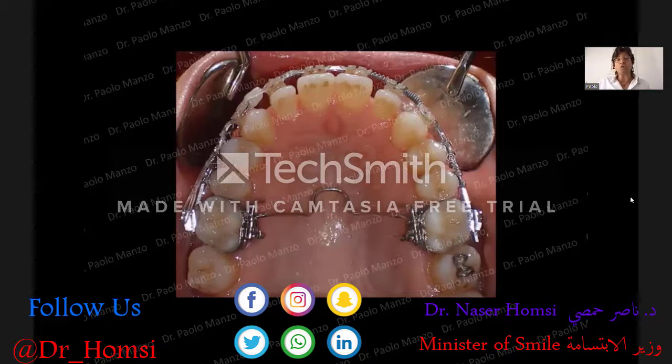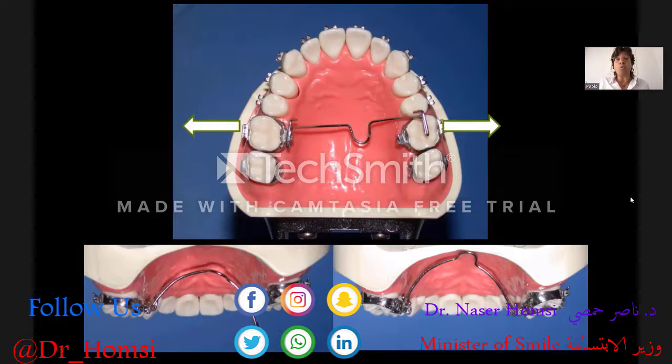And with transpalatal arch, we can expand only one side, like the right side. How to expand only one side with a transpalatal arch? The transpalatal arch is one single device. So if we expand like this, we expand at left side and also at right side. We cannot split this force. But we can introduce on one side some root buccal torque. Root buccal torque expresses some extrusion on one side, and intrusion on the opposite side, and also some root negative torque.